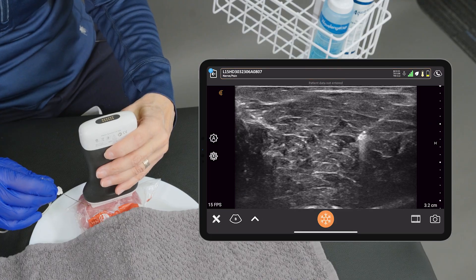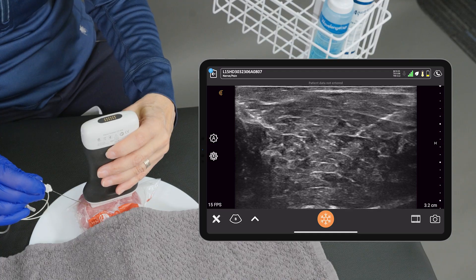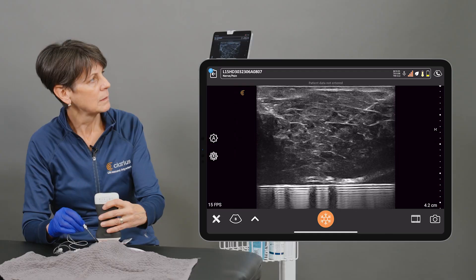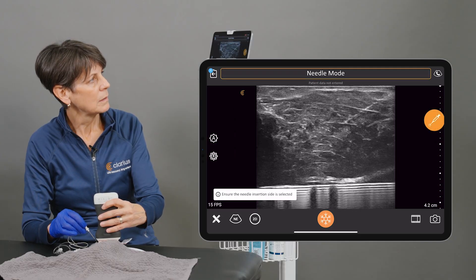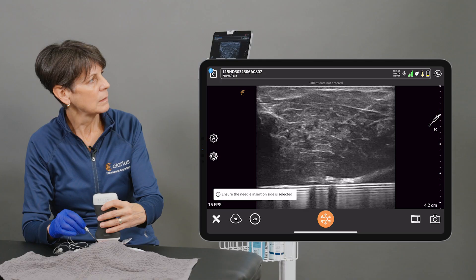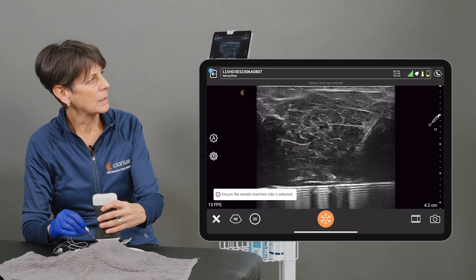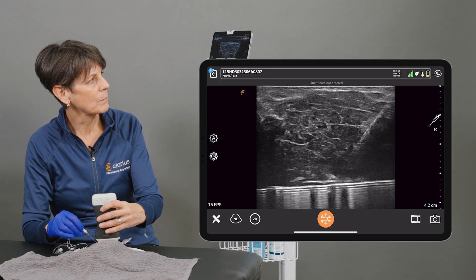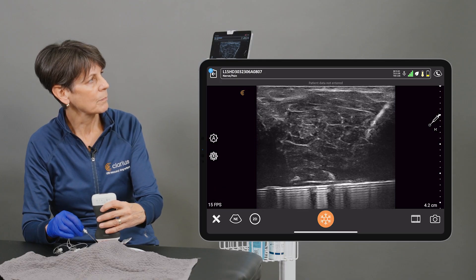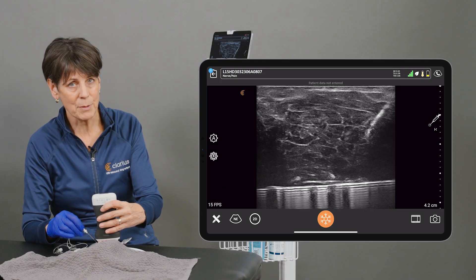If I increase the trajectory of my needle — Needle Mode — it really lights up your needle there, even at this steep of an angle.